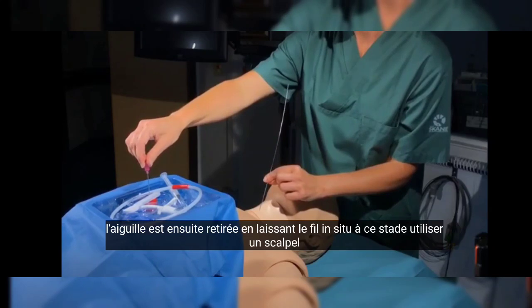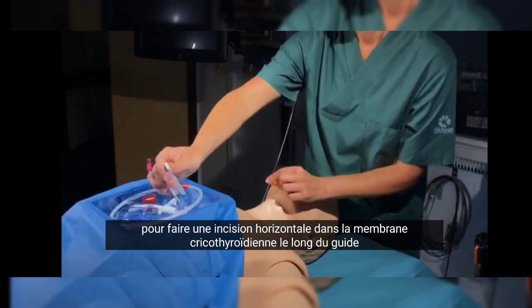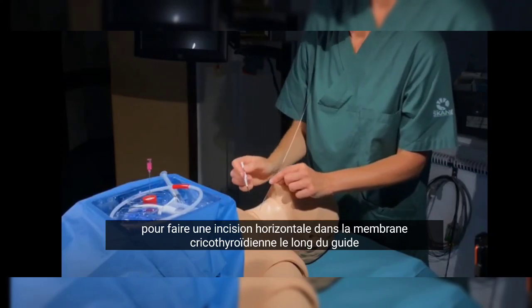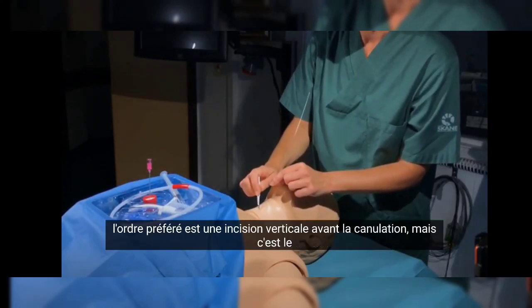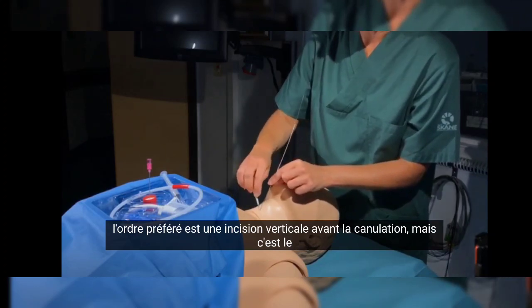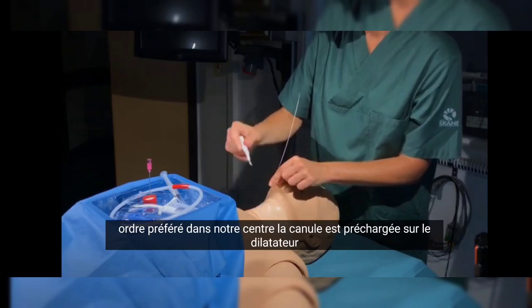At this point, use a scalpel to make a horizontal incision into the cricothyroid membrane along the guide wire. Note that some experts argue that the preferred order is a vertical incision prior to cannulation, but this is the preferred order at our centre.